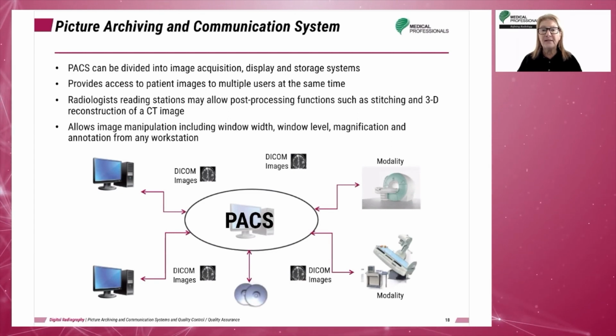PACS basically functions as the radiology file room and the radiology reading room. In the film screen environment, images could only be viewed on site or copied and mailed out. Lost or misfiled images had to be repeated, leading to unnecessary exposure to the patient.